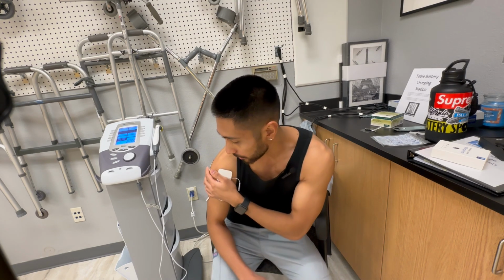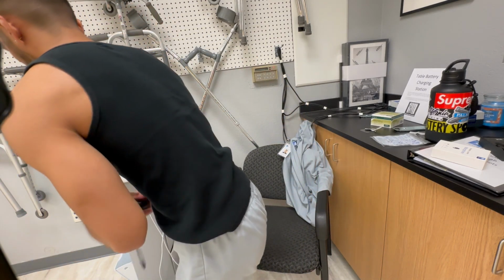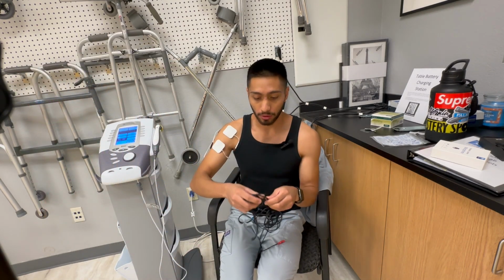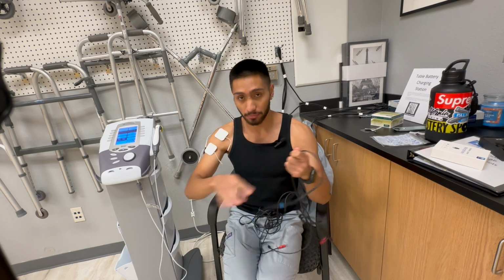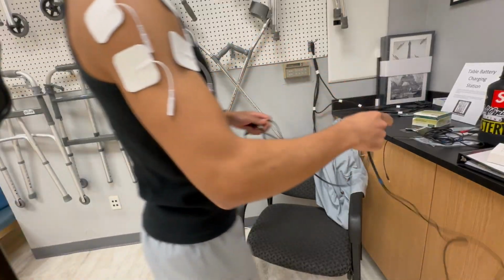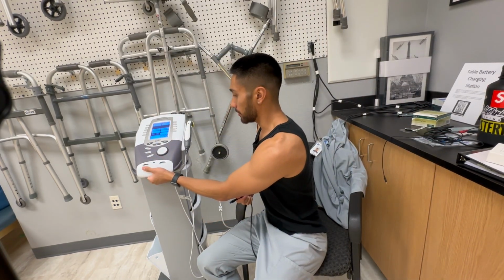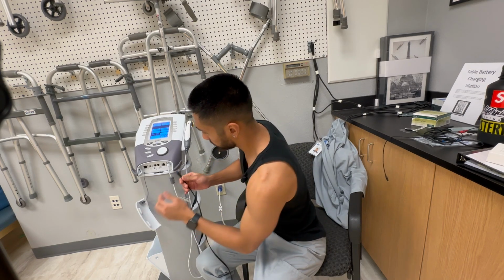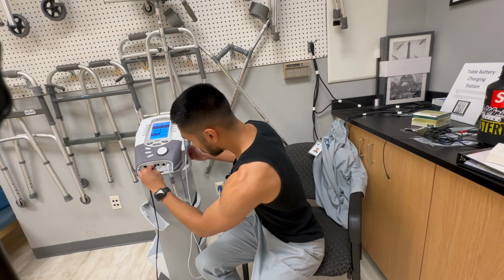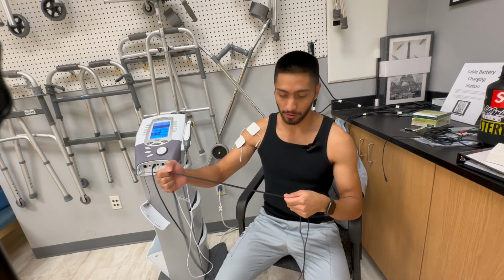We'll go ahead and plug in the wires into the machine. These are the two wires. The important part is that these wires will cross between channels. Make sure it's in frame. Pull this little thing off. Plug it into the first channel, number 1. Perfect. And the important part is crossing.